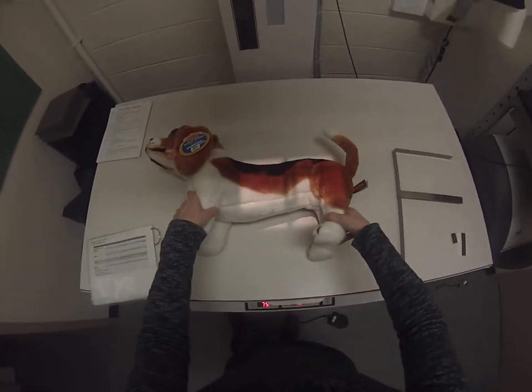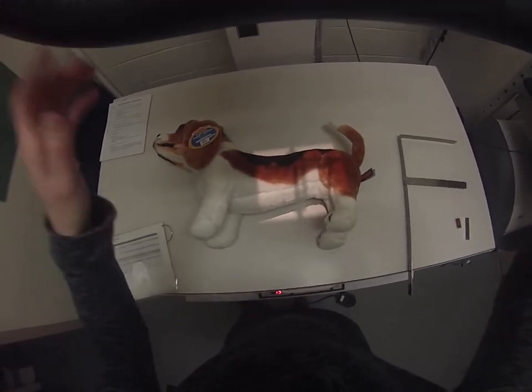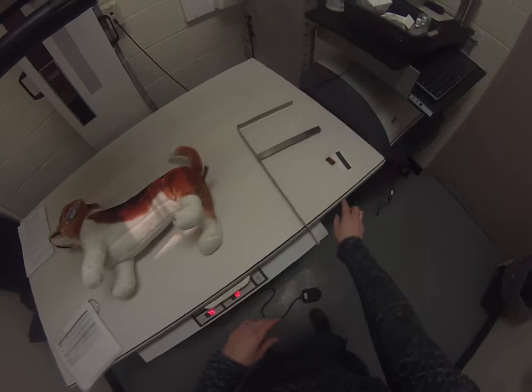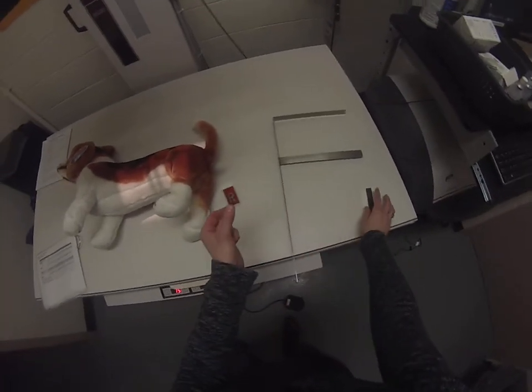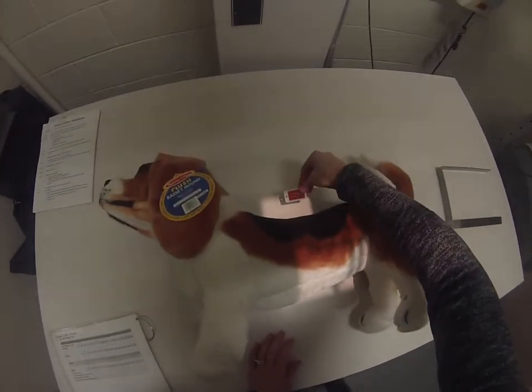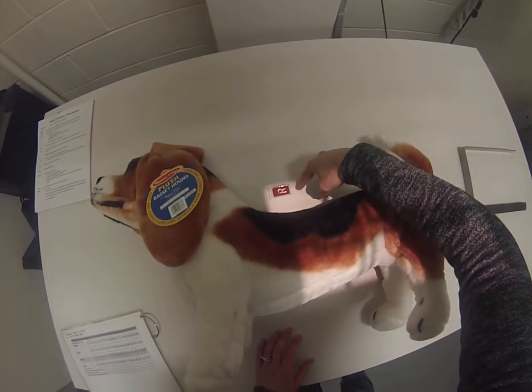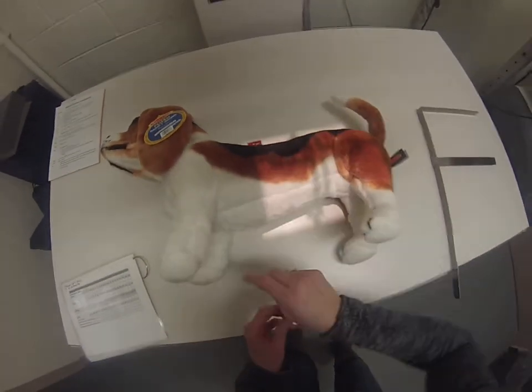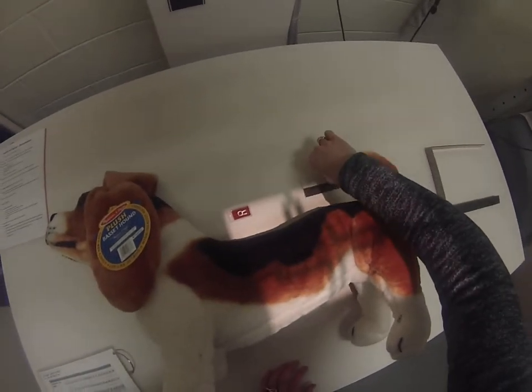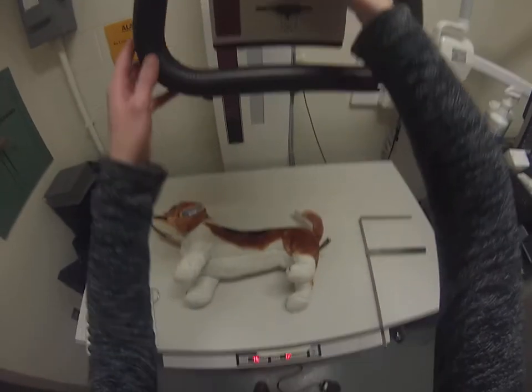We would then get our patient into position. Remember, we need to collimate — make our area only as big as necessary — and sometimes we do need to adjust the position of our patient a little bit. With radiographs, it's very important to include a right and/or left marker. This is a right lateral, so we would include the right marker, placing it up in the corner so it's out of the way of any anatomy but still included in the light field to ensure it shows up on the finished radiograph. We also need to include a label with patient and clinic information, also placed in the corner within the light field.